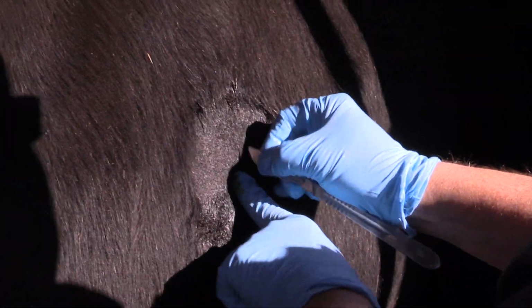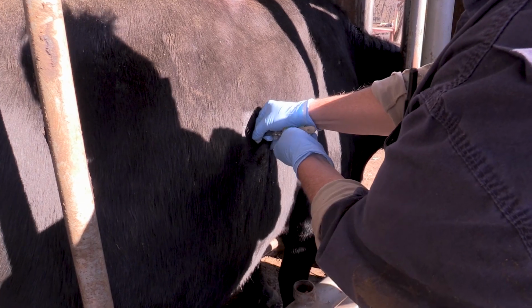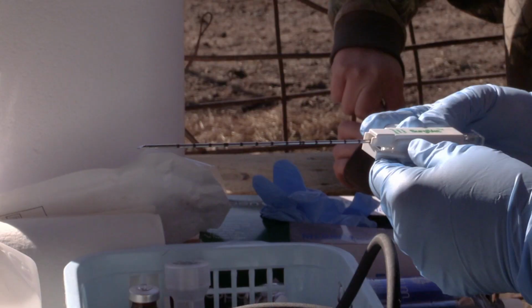Scrub the clipped area with betadine several times. Spray or wipe with isopropyl alcohol. Make a stab incision with a scalpel blade completely through the dermis. Try to stay in the middle of the intercostal space, but certainly avoid the caudal portion of the 10th rib.